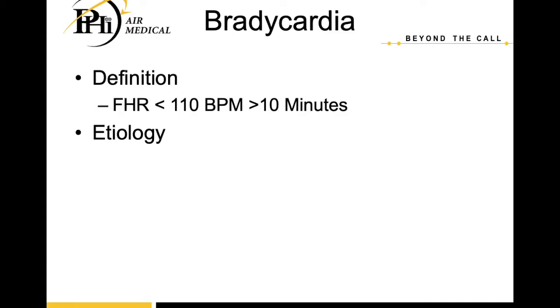Fetal bradycardia is obviously a little more concerning to us than tachycardia is. Typically, we'll see it as a very late sign of hypoxemia. Typically, you'll have a lot of deceleration events before you start to have a sustained bradycardia. Mom could be taking beta blockers, like did they just get a bunch of labetalol? Mom could be hypotensive. We definitely want to make sure that if mom is hypotensive, we're repositioning her, and we are going to be treating that hypotension aggressively with either fluids or pressors.